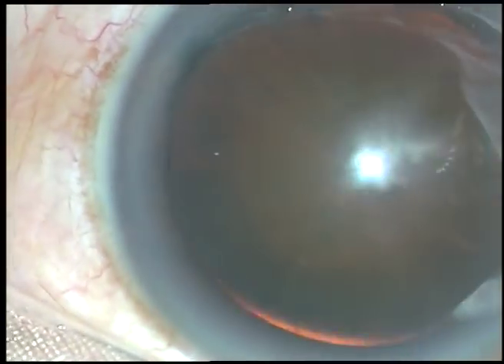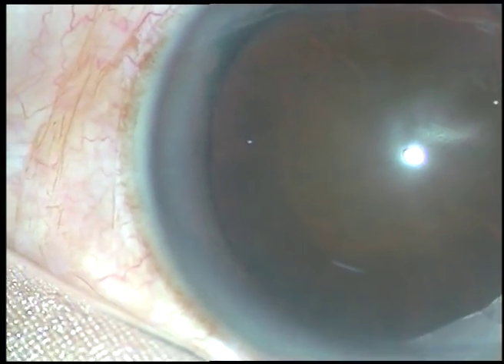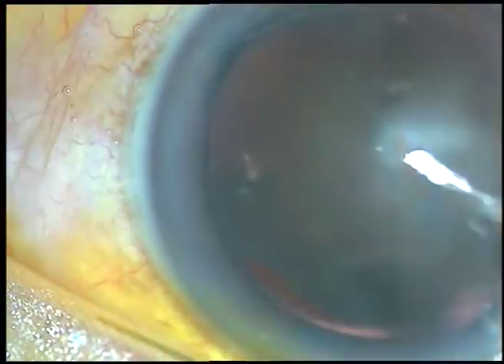Friends, welcome to Oslo, Norway. This is a totally unedited phacosurgery.